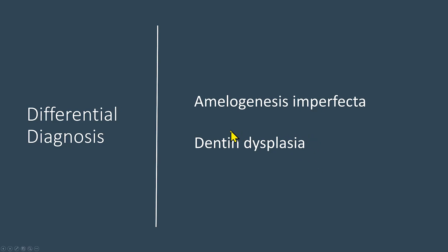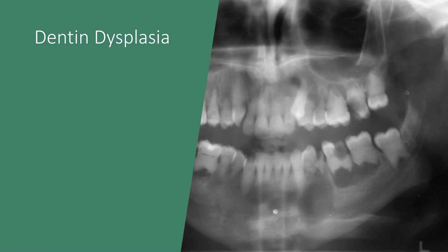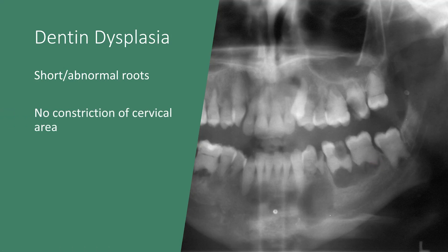The problem comes with identifying dentin dysplasia, so let's review one radiograph of a patient with dentin dysplasia. This panoramic radiograph shows a patient with dentin dysplasia. Here we have short or abnormal roots, whereas in dentinogenesis imperfecta we saw normal root shape. The crown is normal size, just like dentinogenesis imperfecta. However, in dentinogenesis imperfecta we saw constriction of the cervical area, but in dentin dysplasia there is no such constriction.